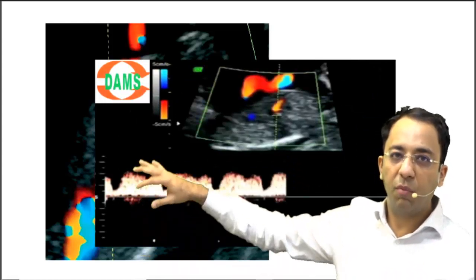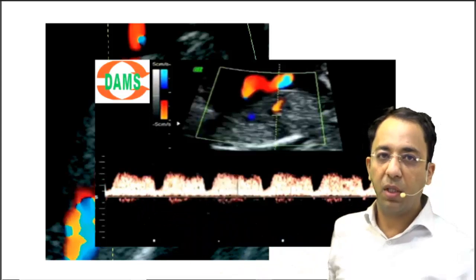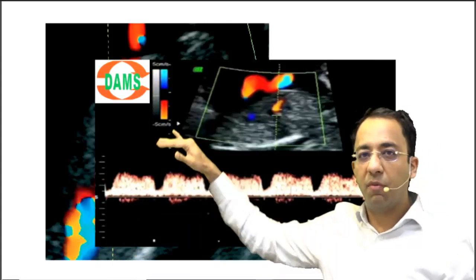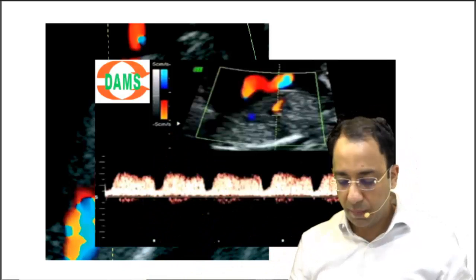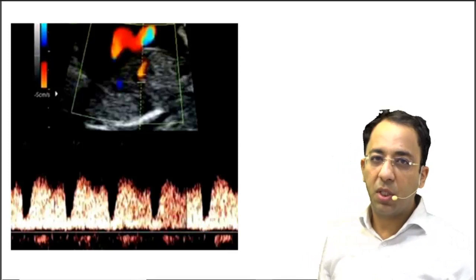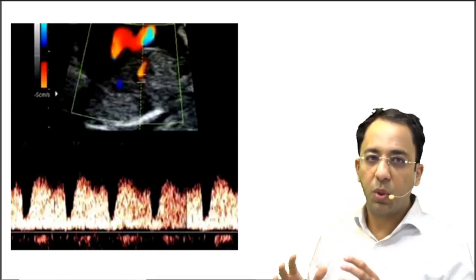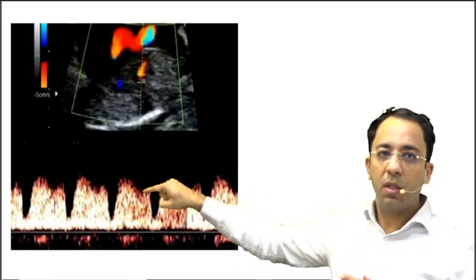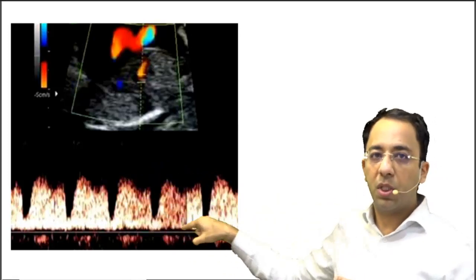This is how the waveform will look, and you can see it has a characteristic triphasic pattern. It is triphasic but it is always above the baseline — it is not going below the baseline in the image. We saw three peaks: one slightly larger peak, one below it, and one below that, but never touching the baseline.